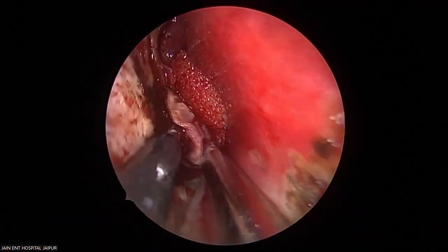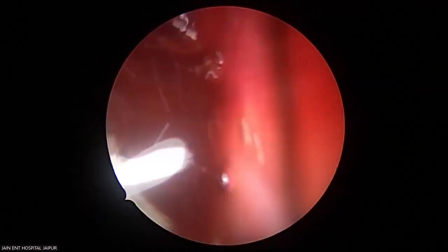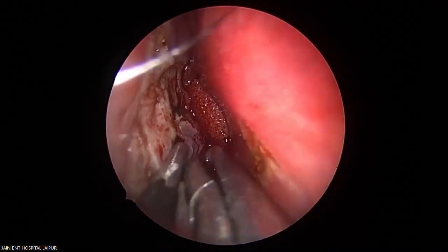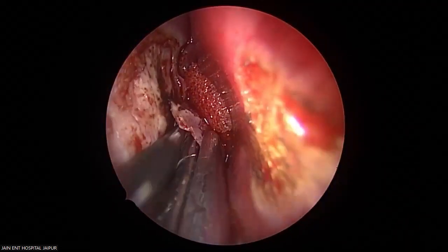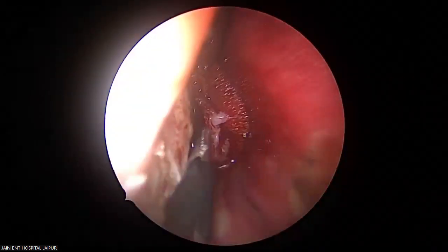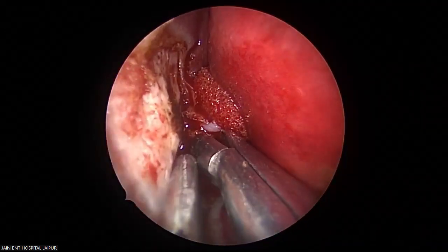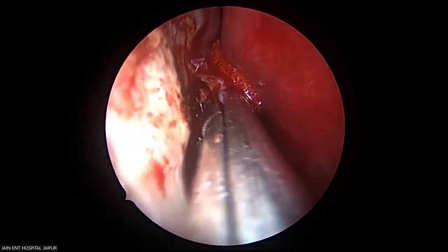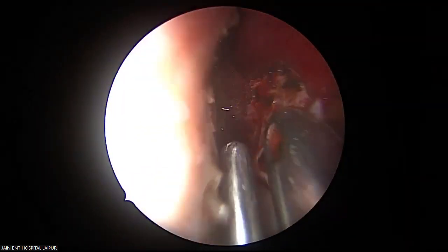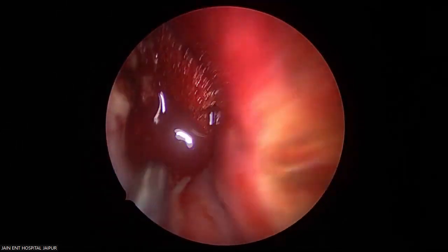Irrigation all the way continues. This is what my assistant has been doing: irrigation, irrigation, irrigation. That's the inferior turbinate bone. See this? Completely out. As you go behind, more and more bone has to go. Coblator.